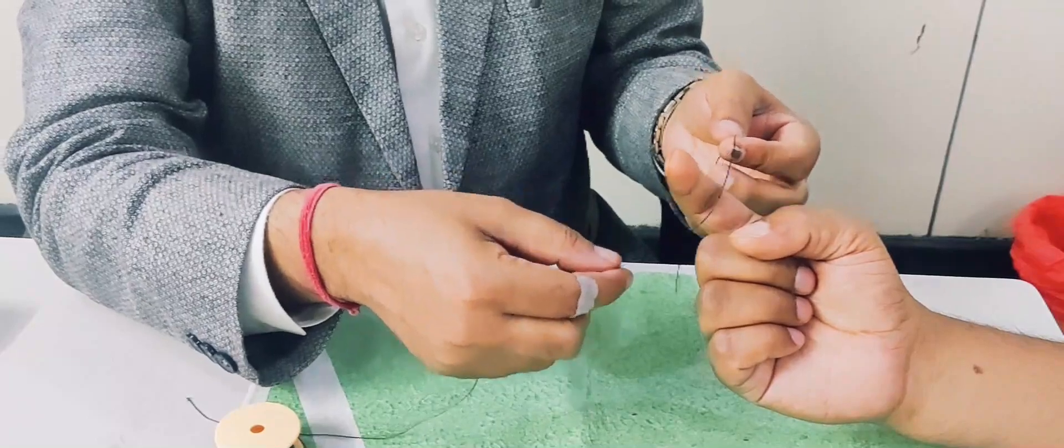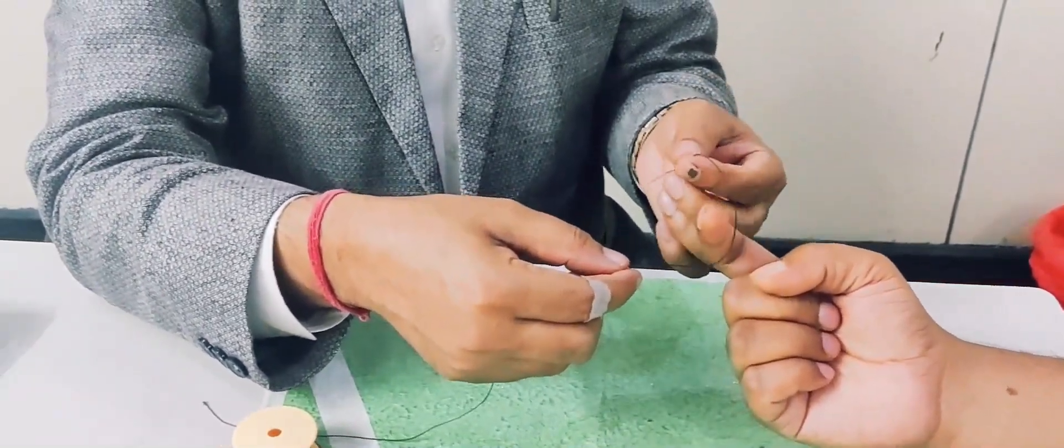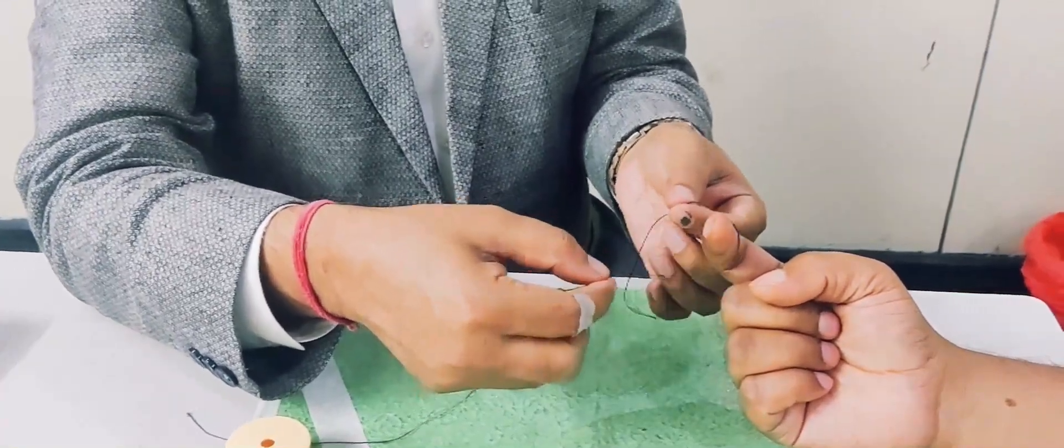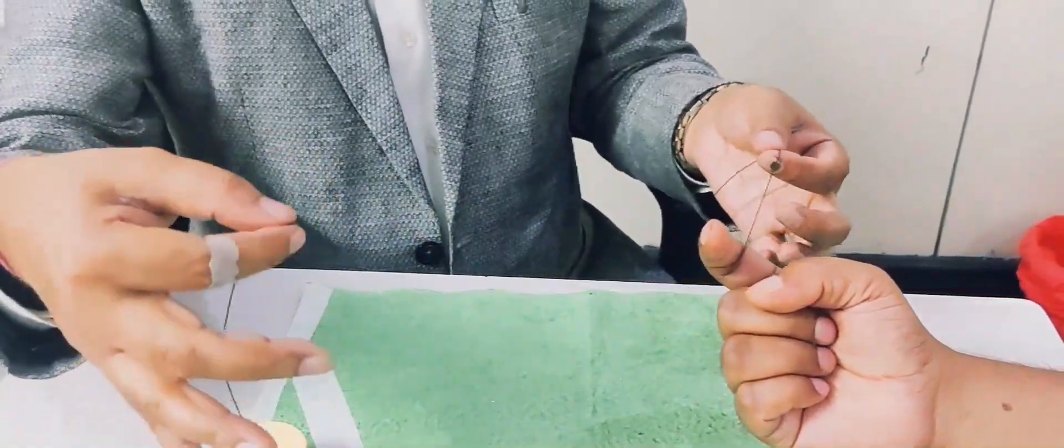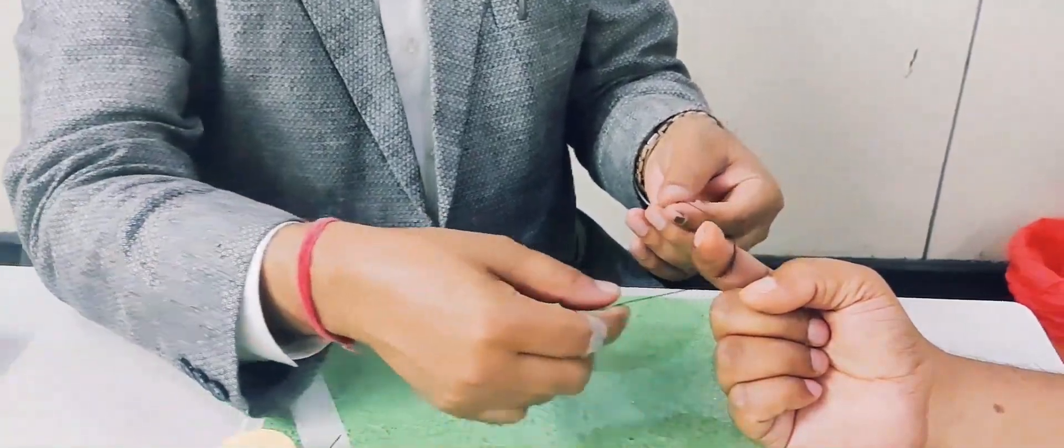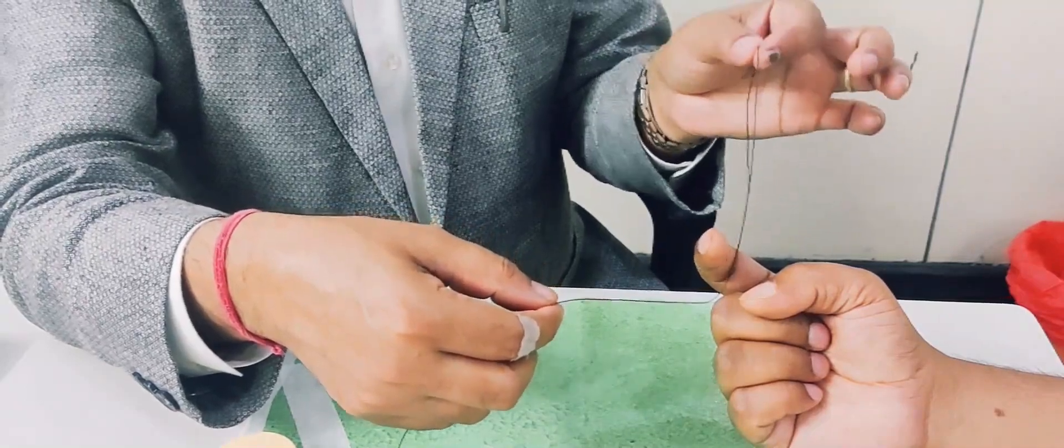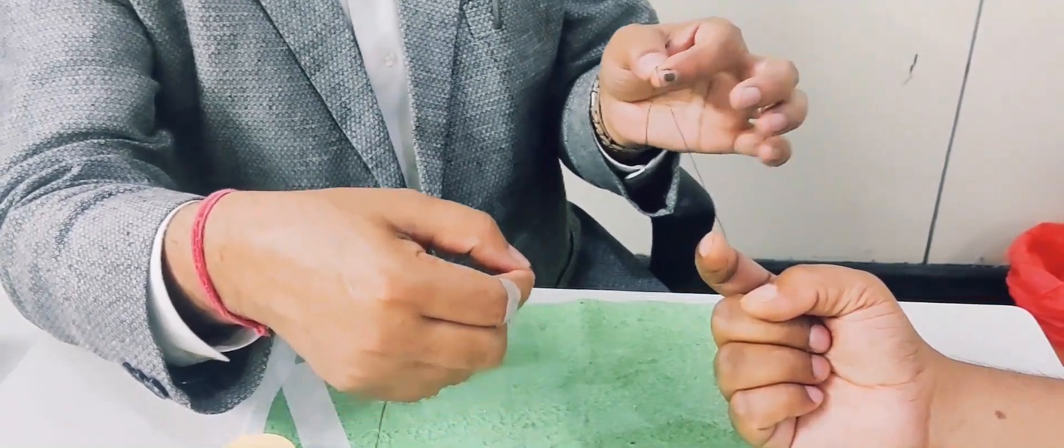Now I will demonstrate you the second technique where I will do the left arm shorter arm. So how we do this? This is the second technique. We hold the thread. It could be vicryl, it could be silk, or it could be any other thread. So we are holding the thread and you can see the left arm has to be shorter for this knot.